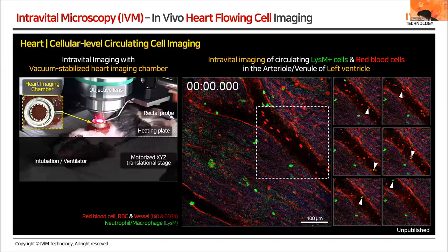And then, can we use this for studying iPSC cardiomyocytes? Well, yes, you can, because we can image the heart and also all other different muscles. And then, how deep into the brain can we visualize? Well, in the brain, it depends, but using two-photon imaging mode, we can normally image up to 500 micrometers.